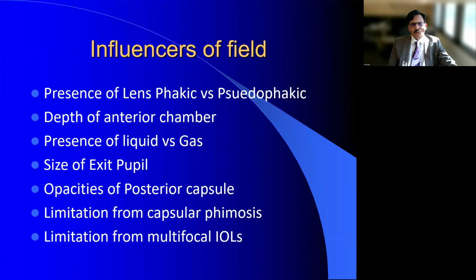So the more the nodal point moves anteriorly, the wider your visualization becomes. This is a practical tip that most people don't know. Sometimes, if you're compromised and it's a large myopic eye, you can do a paracentesis and fill with a little bit of Viscoat or Provisc. That gives you a shallow anterior chamber and a much wider view.